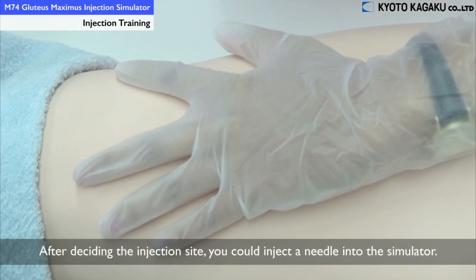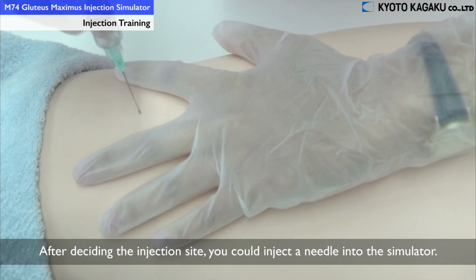After deciding the injection site, you could inject your needle into the simulator.